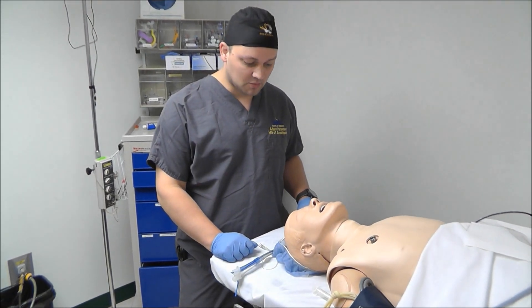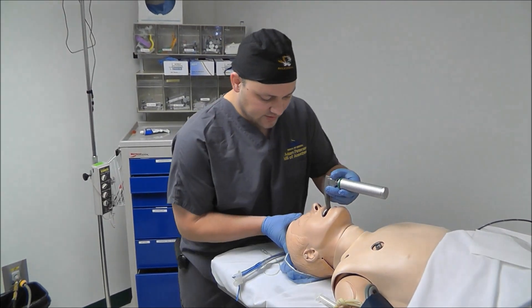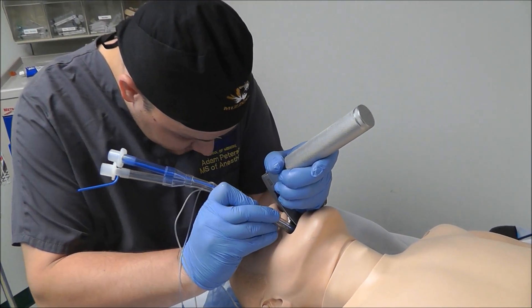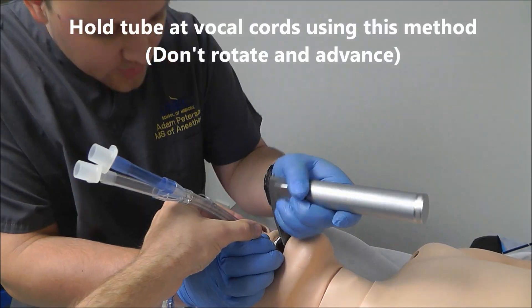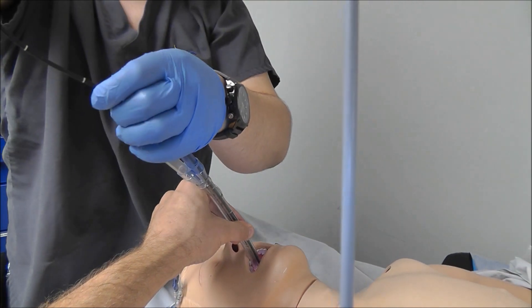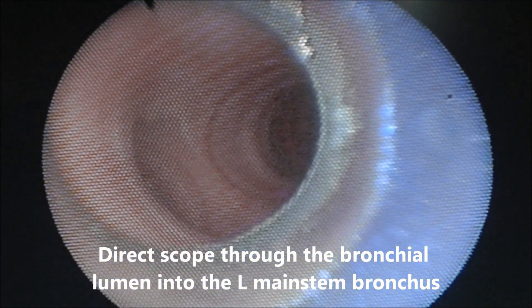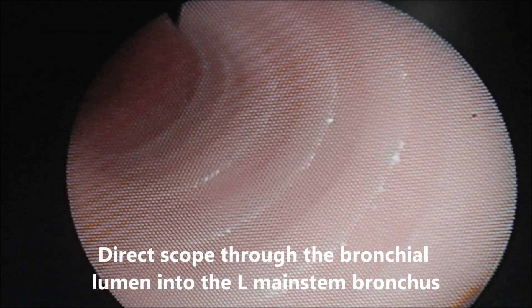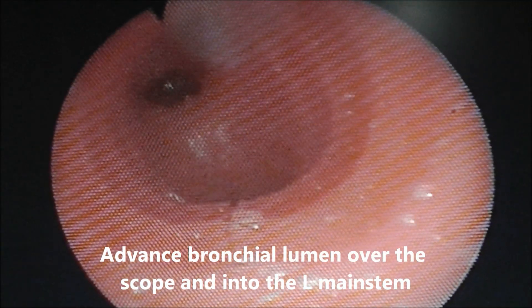The last method is a combination of direct laryngoscopy along with fiber-optic. Perform your laryngoscopy like normal and insert the double lumen tube in the same manner to the level of the cords. At this moment, have an assistant pull the stylet and hold the tube. You can remove your blade and insert the fiber-optic scope through the bronchial lumen. Advance the scope past the tube itself — when you exit the tube, you should see the carina in front of you. Advance and direct the scope into the left bronchus, and your assistant can advance the tube over the fiber-optic scope into the left bronchus.